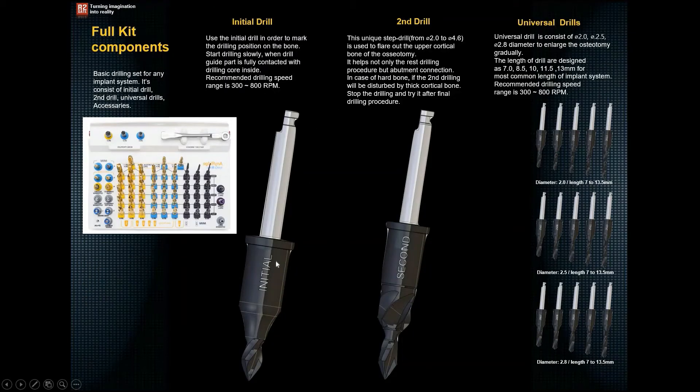The initial drill is what we call the marking drill. It is a very short drill used only to mark the position of the osteotomy, and then to guide subsequent drills into the correct position. The second drill has the same tip as the initial drill, but additionally has a part that profiles the cortical bone, enabling you to place the next universal drills very smoothly.